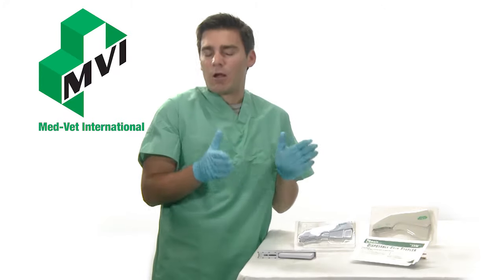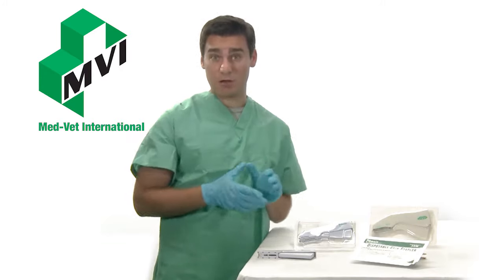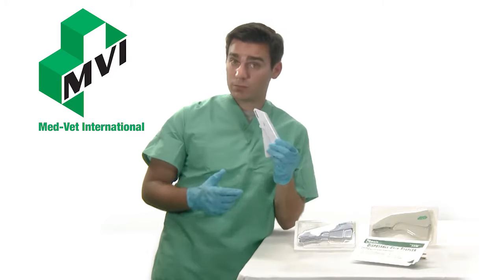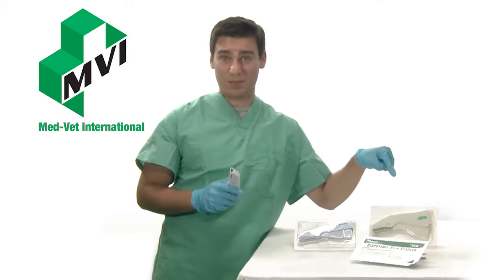Hi, let's talk about our outstanding skin staplers. We have three different types of staplers here at MedVet International: the Oasis 35R, a regular skin stapler; the 35W, a wide skin stapler; and the AHS Premium skin stapler.